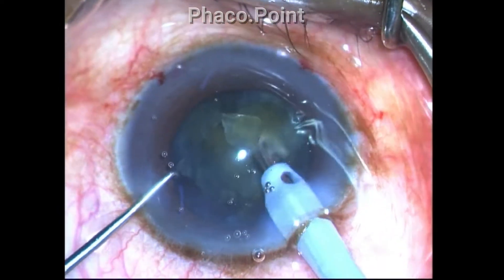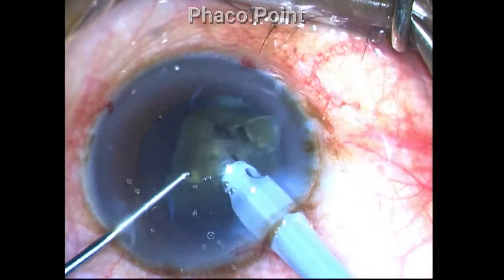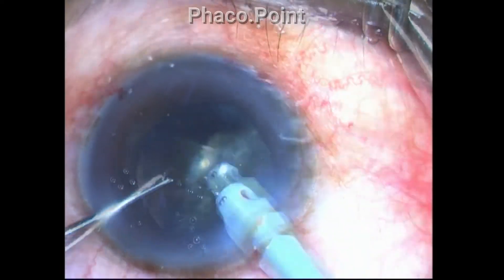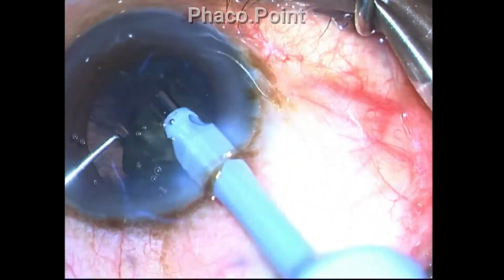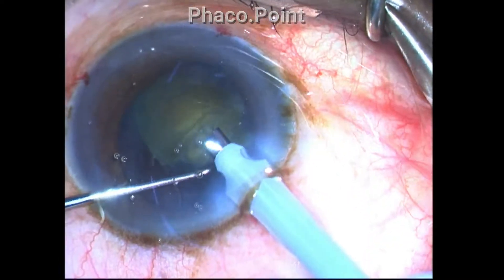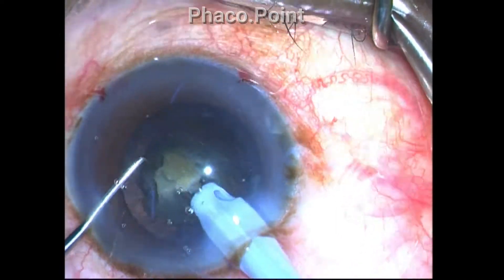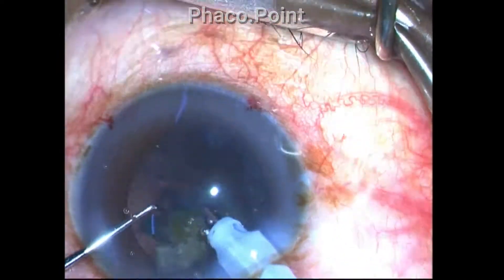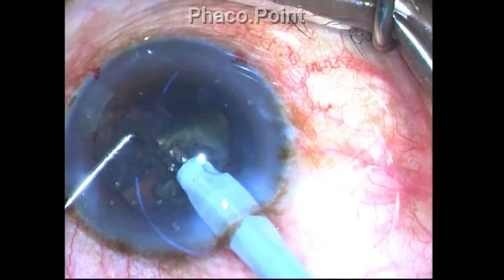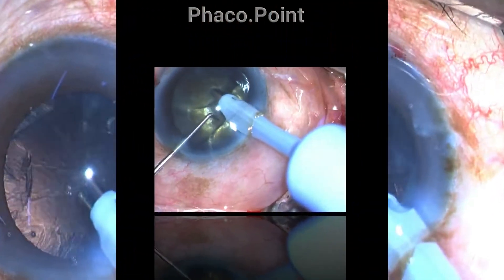One needs to be very careful when mobilizing nuclear fragments — do not mobilize large pieces of nucleus because they will break down into smaller shrapnel that has the potential to damage the endothelium. If you see any shrapnel in the anterior chamber, address it first before mobilizing the next piece. In this case, I am not doing that — I'm ignoring the shrapnel and moving to the underlying piece, leaving that fragment free to roam around and hit against the endothelium.